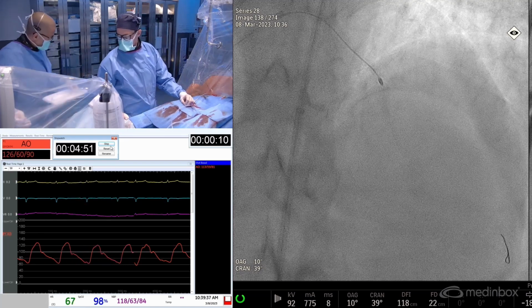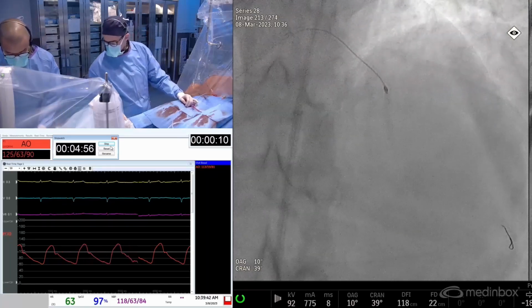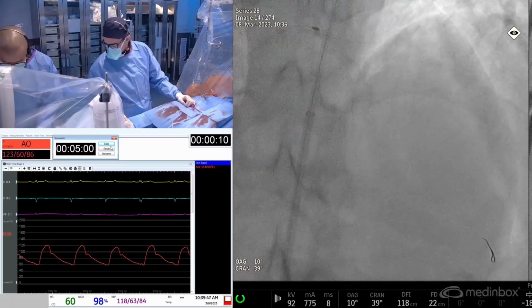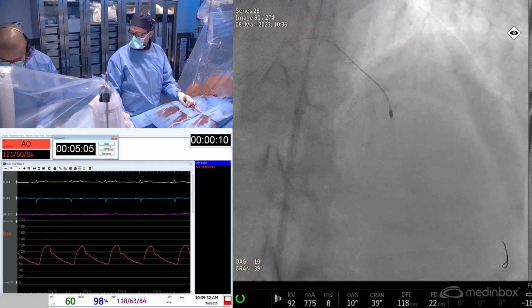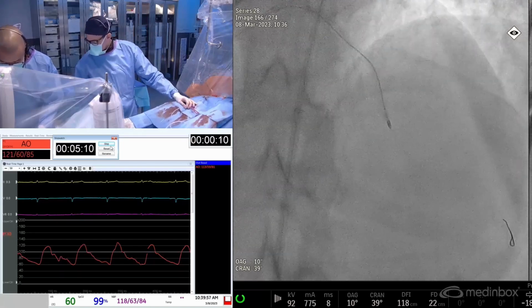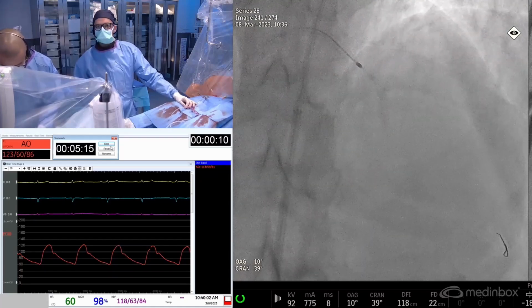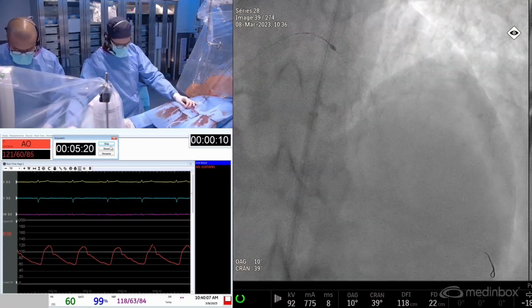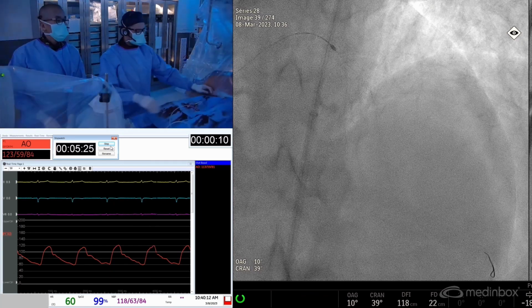So as we all know, when we get the rotor, I think nowadays in 2023, the most challenging part of doing rotational atherectomy is assembling it. We have to all get comfortable with this. I think we were discussing Renovate Complex PCI that was just released at ACC and published simultaneously in the New England Journal. But you won't be able to get the results you want to be confirmed by imaging, such as stent expansion. We'll just do a cine to see what it looks like. Position. Go ahead.